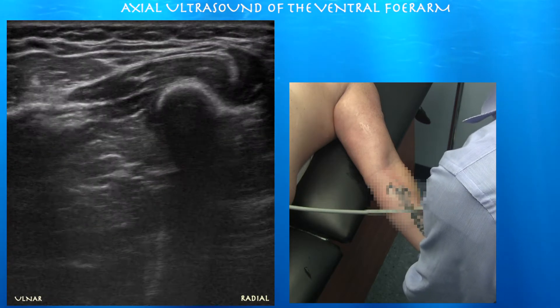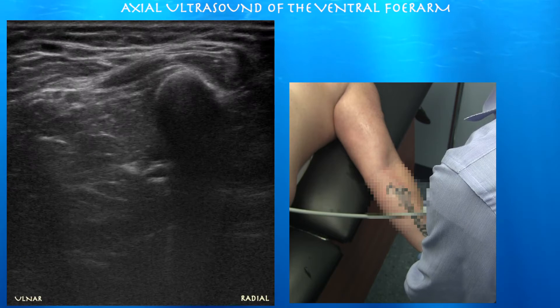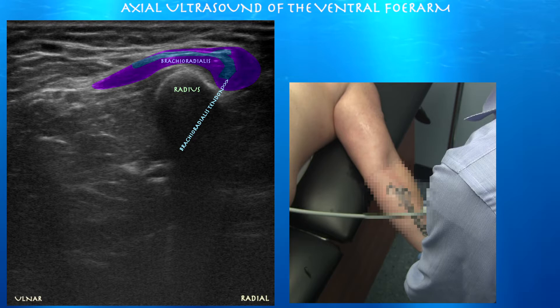Now we're just going towards the wrist. Here we can start seeing the tendon form of the brachioradialis as it inserts on the distal aspect of the radius.